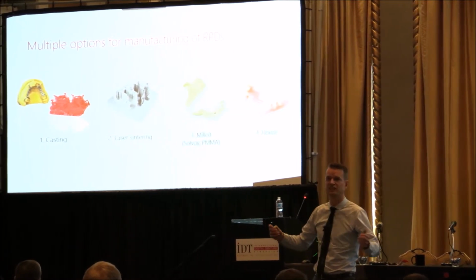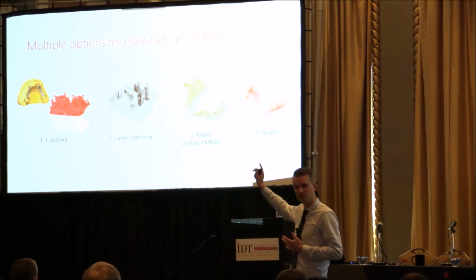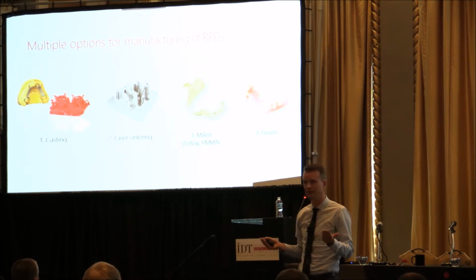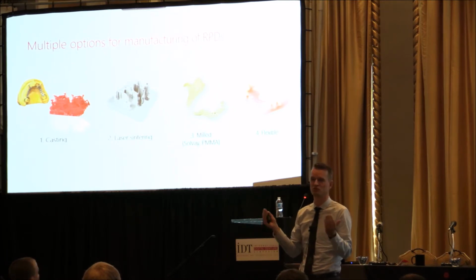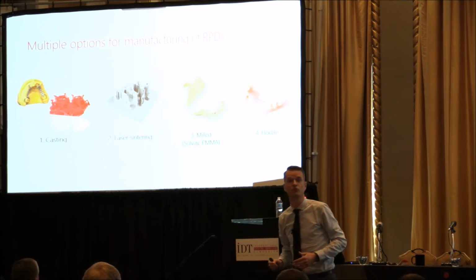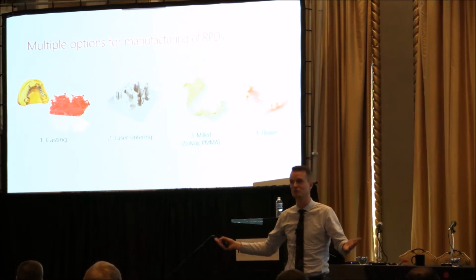There was one saying yesterday, I will always start with conventional. I mean, guys, in the start, you made drawings on the models. But why don't you just draw in the software? We thought the same years ago and fixed it. Drawing on the models was good, but no one does that anymore. I mean, you just set the margin line. You don't sit and make your red line anymore. You just set the margin line in the software. And the same you're going to do with removables and later on also your dentures, as you see. But it can be a transition. Evolution is good, even though we want to do revolution.